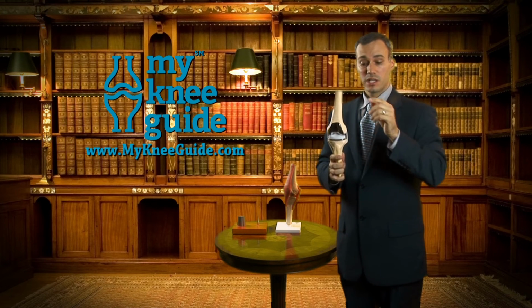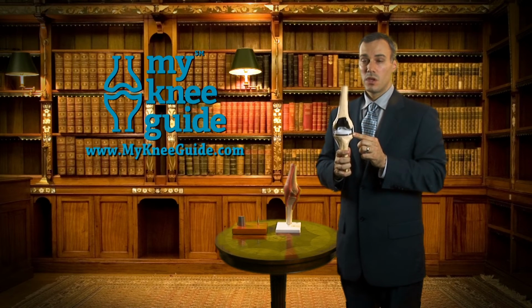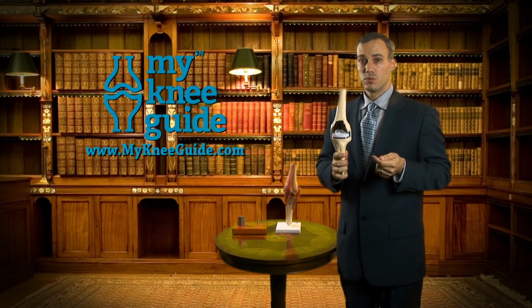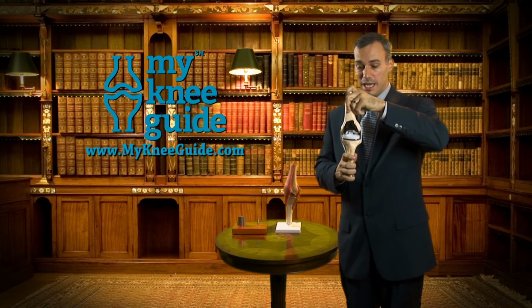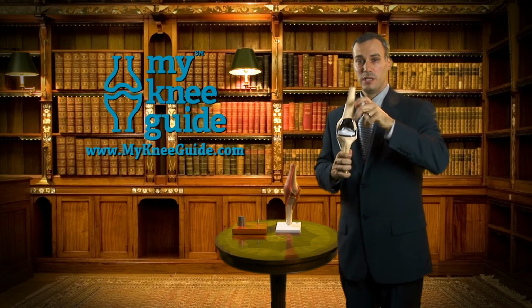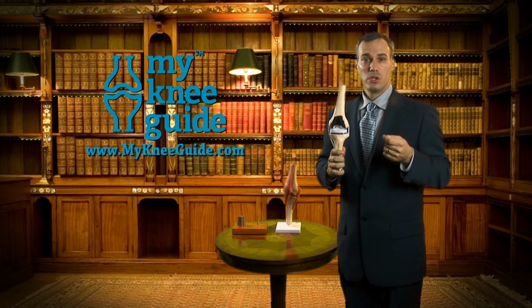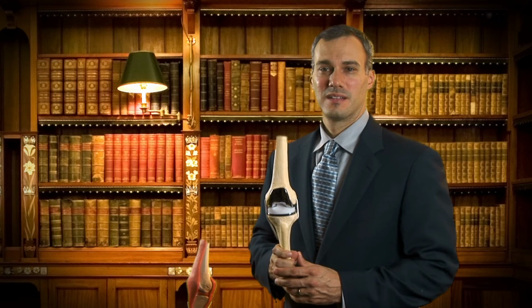The surgeon next will need to evaluate the ligaments on the sides of the knee. Sometimes the arthritic process will have caused the ligaments to have some laxity or tightening on one side or the other. If that occurs, your surgeon may need to do some partial releases of the ligaments in order to reestablish the normal balance of the knee.